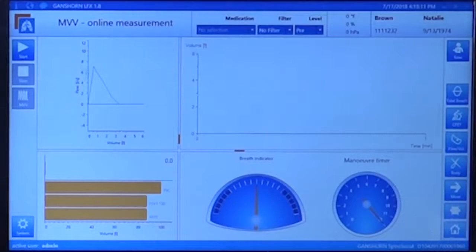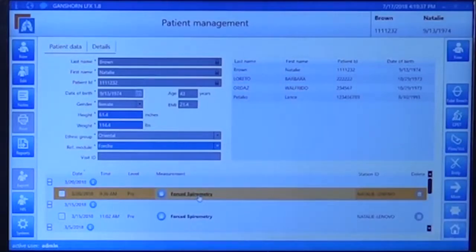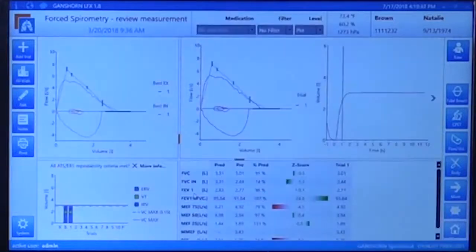Once you perform the test, you go back and just click on the test that you need, double click on it. This is a test that was done a few months ago. And what you will have is 3 different graphs on top. The first one will give you your best inspiration and expiration effort. The second would be all the tests superimposed one on the other. And the third will be the volume time test directly.